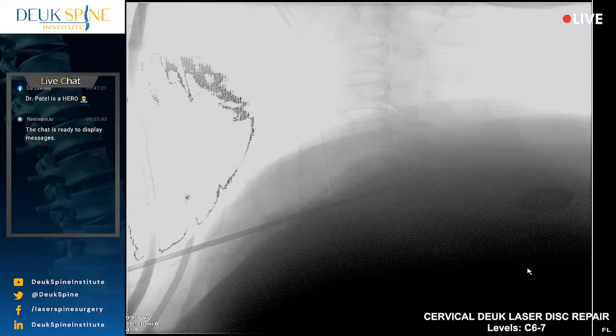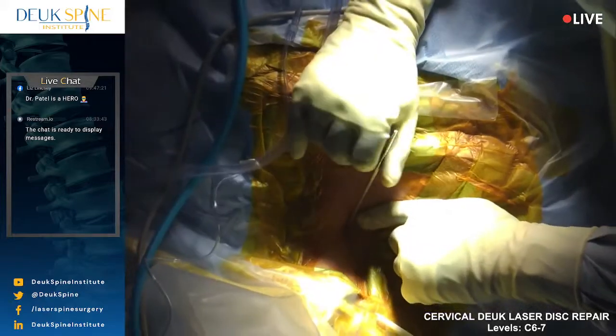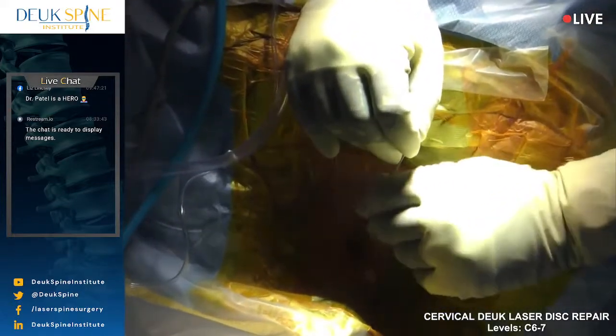Yeah, no, you're fine. I think we're fine here. You can see the bottom of the skull, you can see the C2 bone, and you got 3, 4, 5, 6, 7. And we're doing C6-7. So we're at the right disc. We just verified that, which we knew, but we wanted to make absolutely sure before we start doing our discectomy or Deuk laser disc repair.